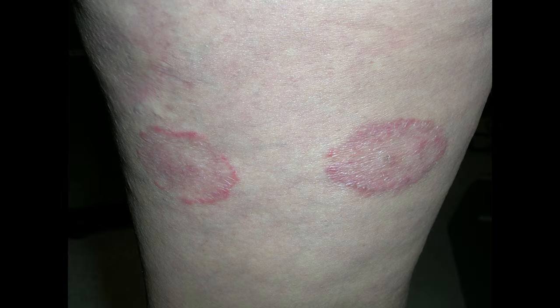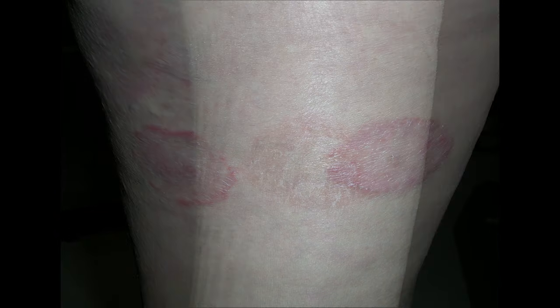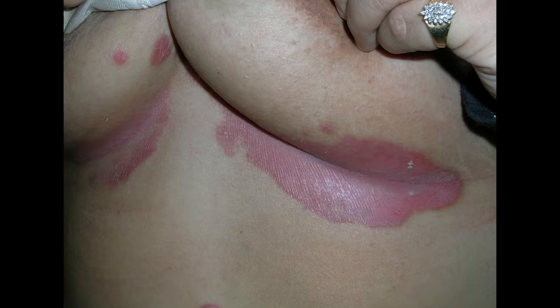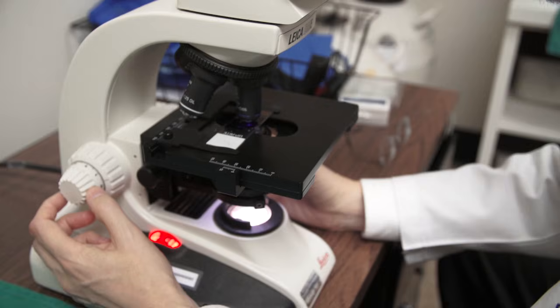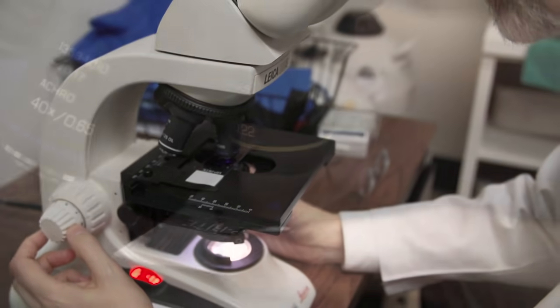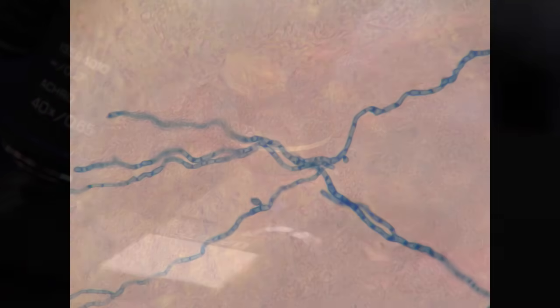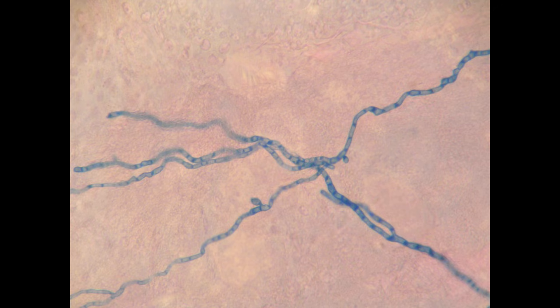It is often difficult to tell the difference between a fungal skin infection, an eczematous eruption, and psoriasis. A properly performed KOH preparation is a powerful tool in the diagnosis of skin diseases.